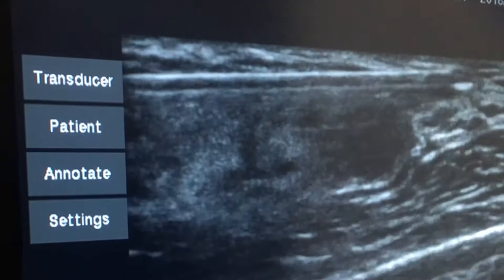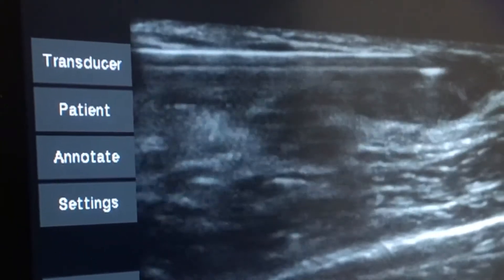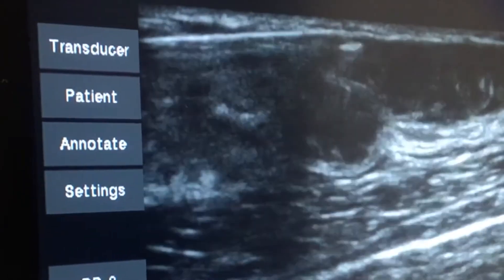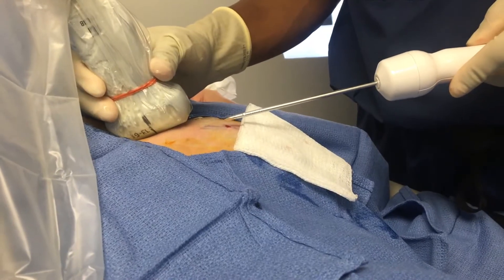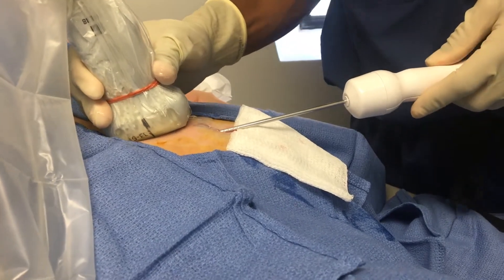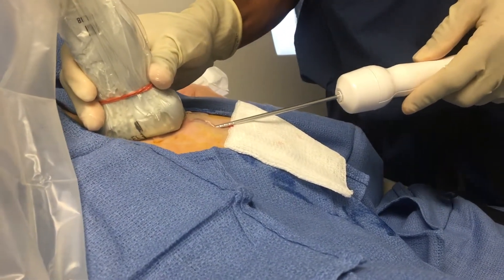Now the needle is inserted past the cancer to inject local anesthetic on the other side of the cancer. Now you see me holding the cryoprobe as I prepare to insert the cryoprobe through the skin nick under ultrasound guidance.